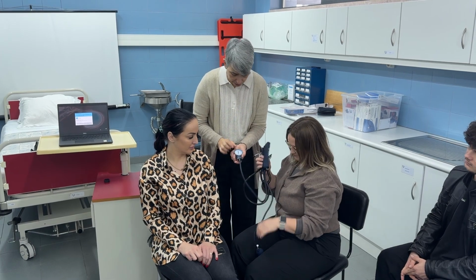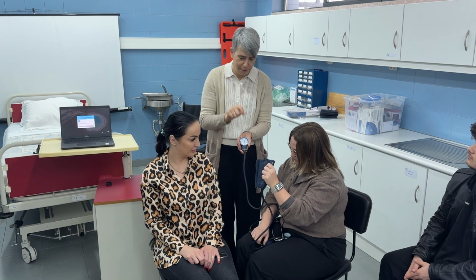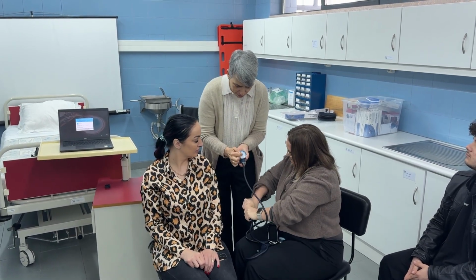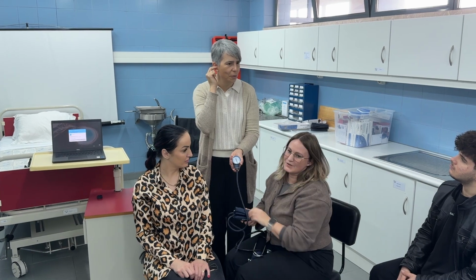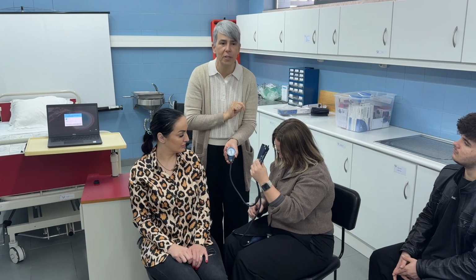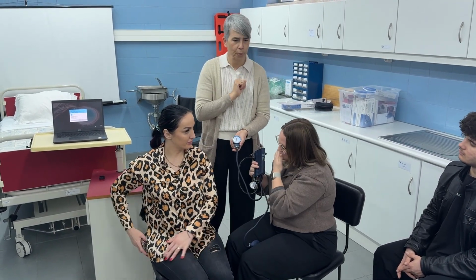Diastolic. The tricky thing is, if you watch this, you will first see pounding, because this small arrow will go like this, and then you say, oh, it's already there. But you really have to concentrate on what you hear, because the moment you hear it, that's the moment. Not when you see it. You understand? Yes. So, let's do it.